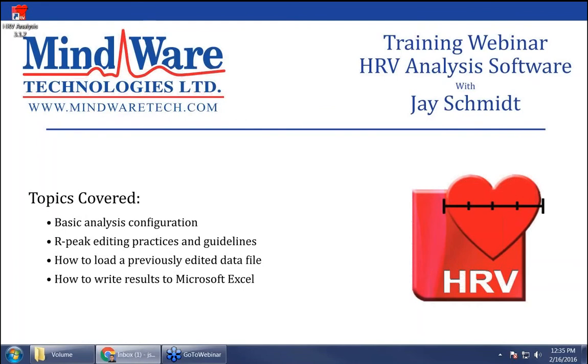Just so everyone's aware, the first 30 minutes of this webinar are going to be used for just demonstration of the software, and then the final 30 minutes we're going to reserve for Q&A. Please feel free to ask any questions as soon as you think of them. We have a few people in the background that are going to answer this for you. And if there's anything a little bit more complicated or complex that would be good for the group, then they'll shoot those questions to me, and then I'll show you a visual of how to answer those.